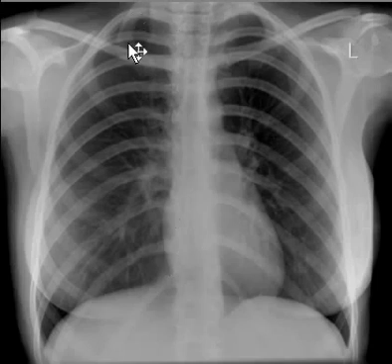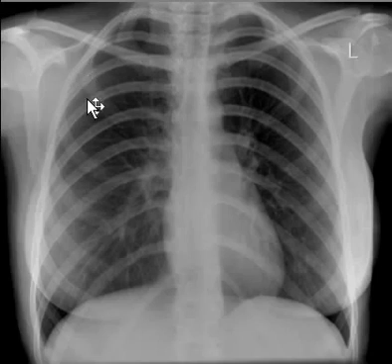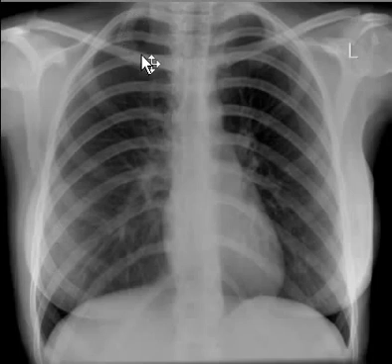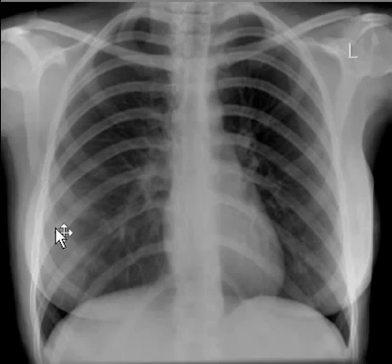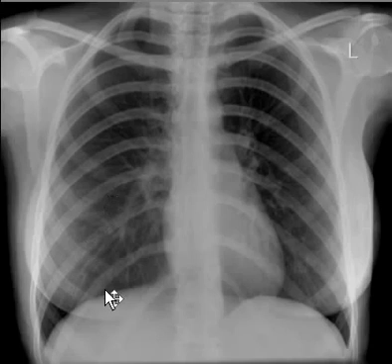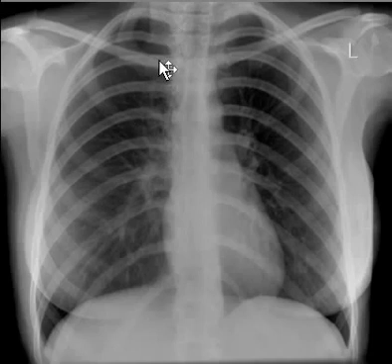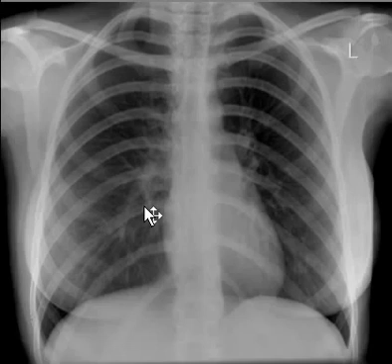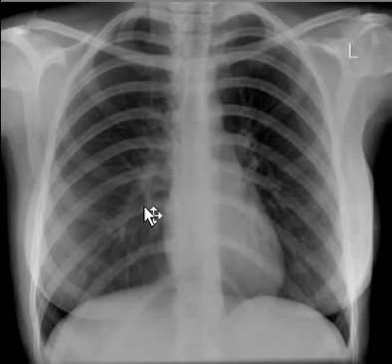Let us count the ribs: 1st anterior, 2nd anterior, 3rd anterior, 4th anterior, 5th anterior, and 6th anterior. This should match to the 9th or 10th posterior rib. Counting posteriorly: 1st through 9th posterior is fully visible. This suggests that the patient does not have any emphysematous lung disease. Both diaphragms are making a dome shape, again confirming the previous suggestion.